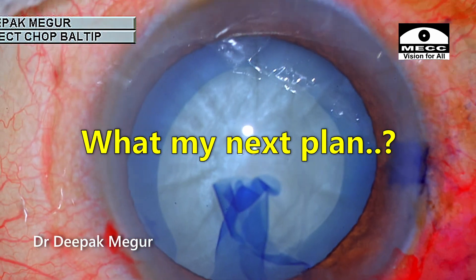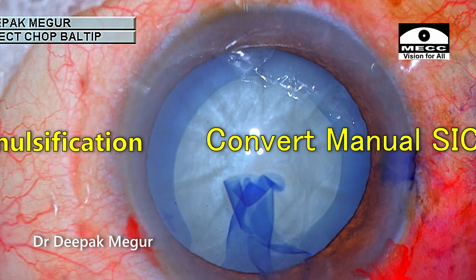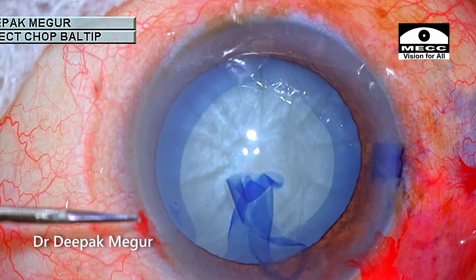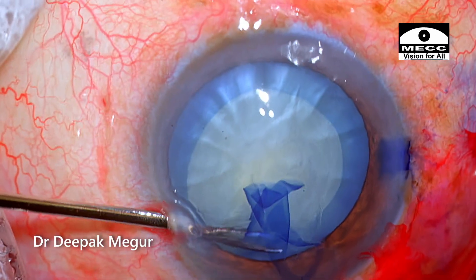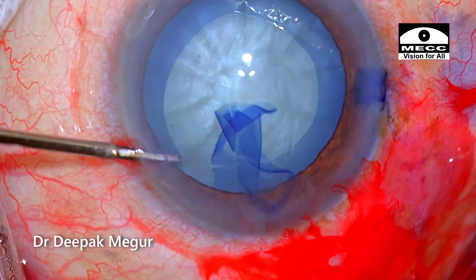One can of course choose to convert to manual SICS or ECCE, but I decided to continue with phacoemulsification, having been in similar situations before. The anterior capsule flap is cut with micro-scissors through the sideport and the flap is removed.